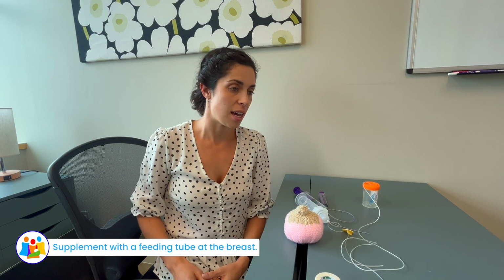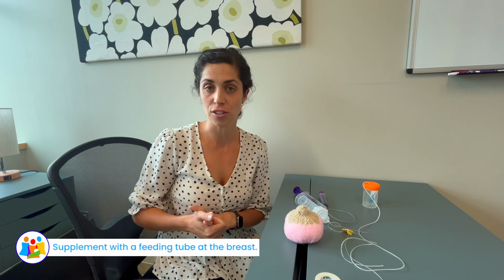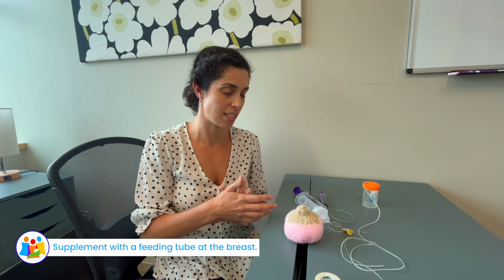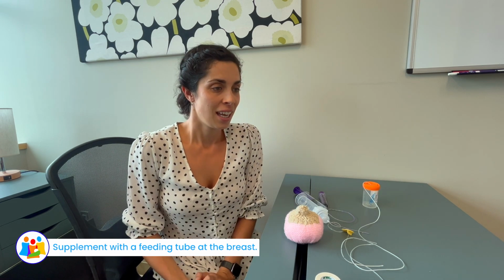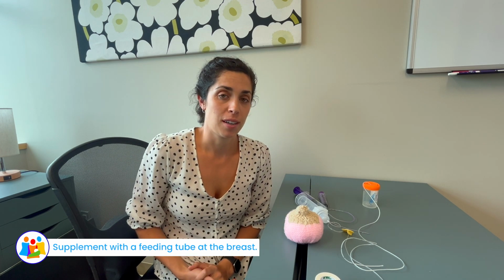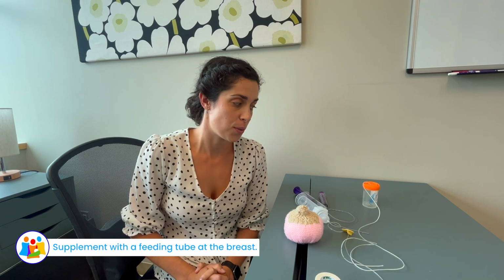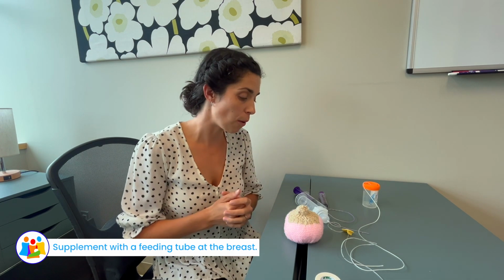And weaning from the device can occur through various strategies, which I'll mention as I explain the device. So the beauty of it is that it really preserves a breastfeeding relationship for dyads where that is really the priority. And so this is now when I'll show you how it works.